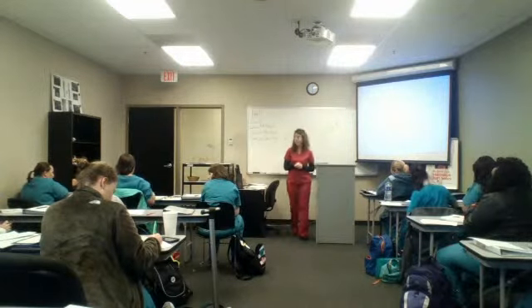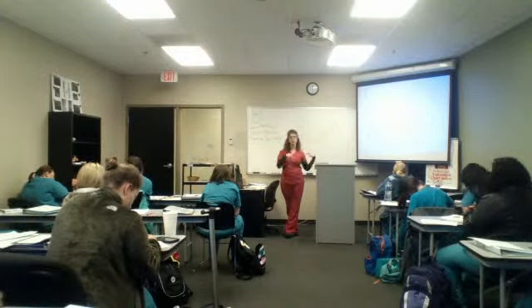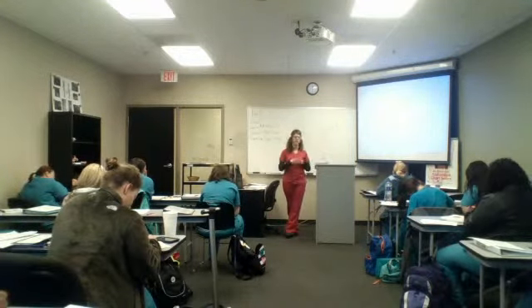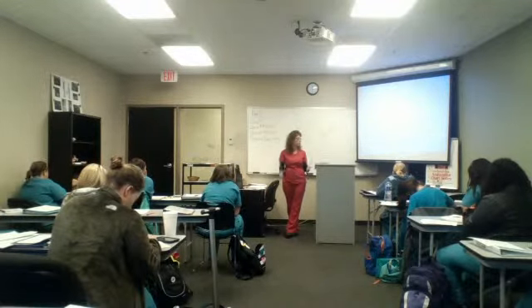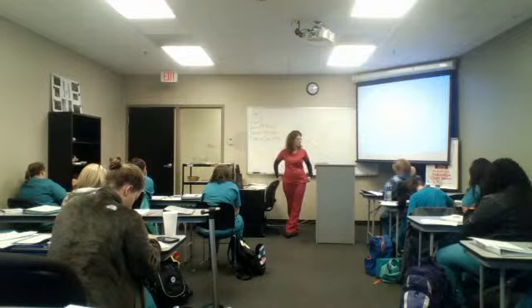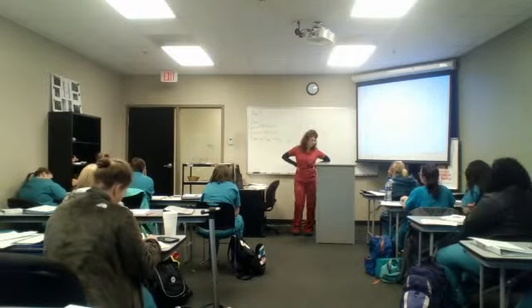This is to check for reflux. Okay? So if they come in, their legs are swollen, they're brown, they've got ulcers, they've got varicose veins. We've got to find out if they have reflux, but we've got to figure out what system it's in first to know what kind of treatment can be done. All right, so to test them, the first thing is to do augmentation.